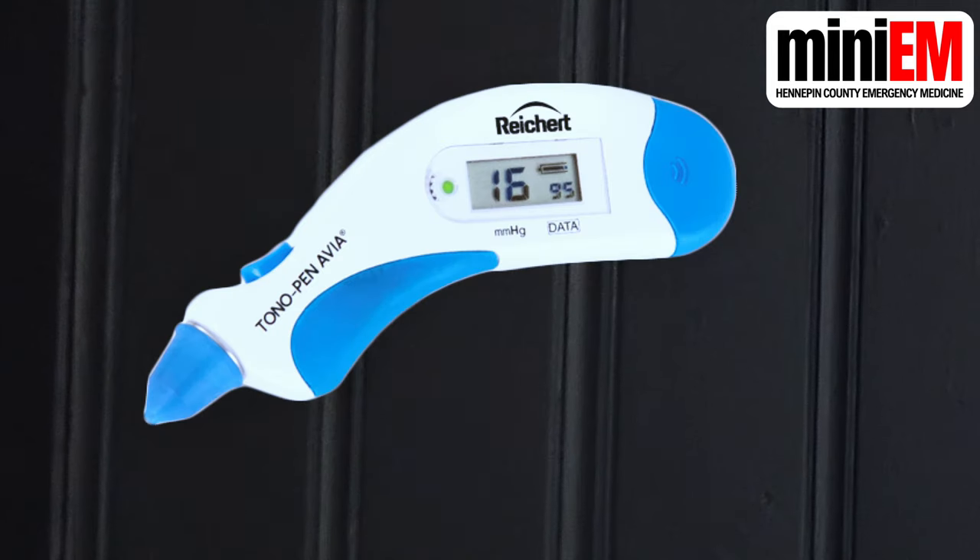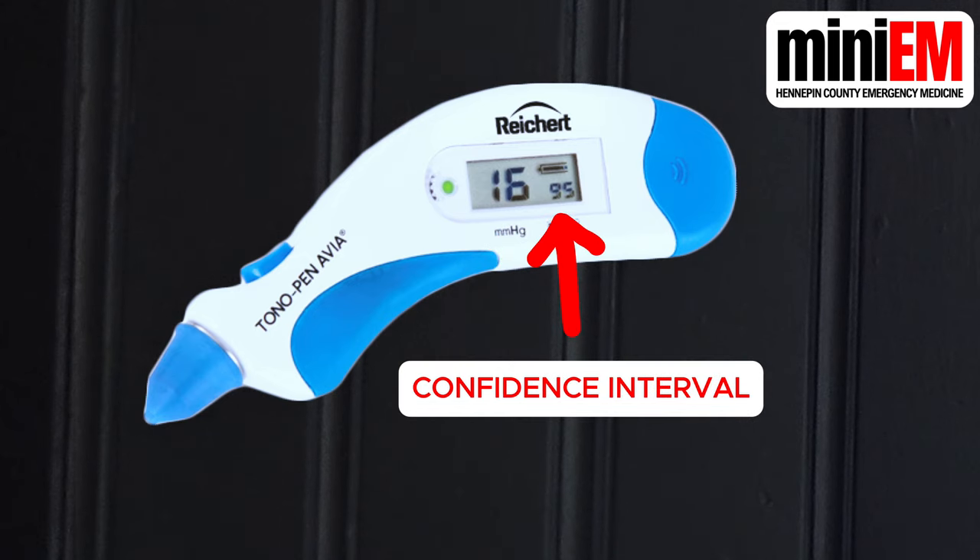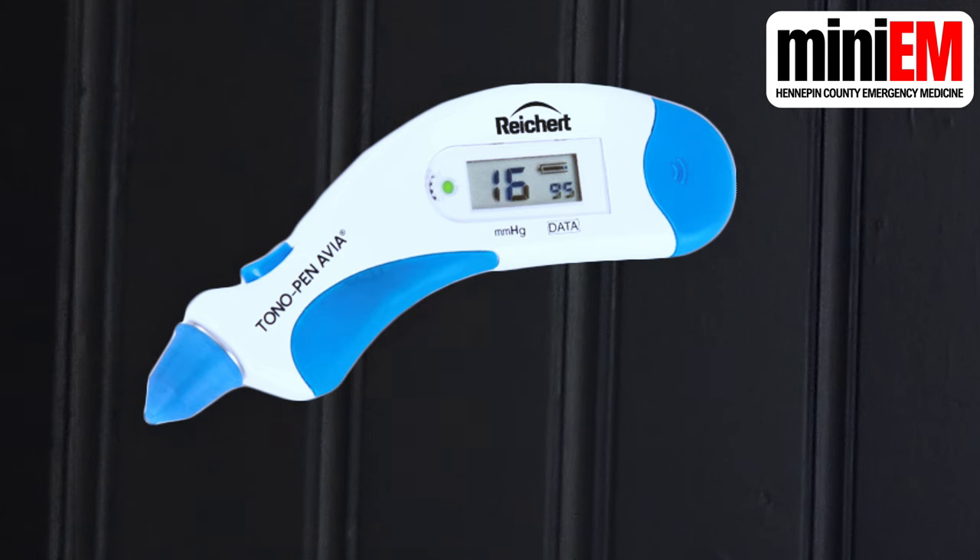Usually it takes somewhere between 6 and 10 measurements. The machine will take the average of all your measurements and display a number on the left part of the screen. The number on the right is a confidence interval for that average. You want a confidence interval that's 95% or above — if it's lower than that, you need to retake your measurements.